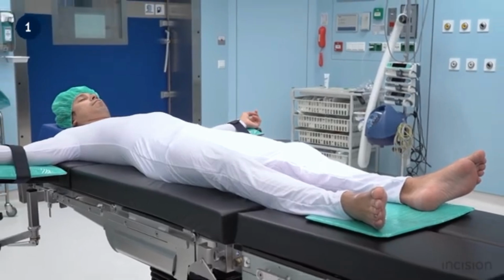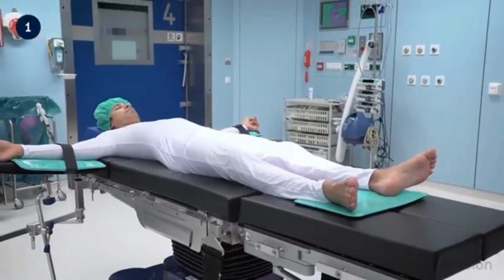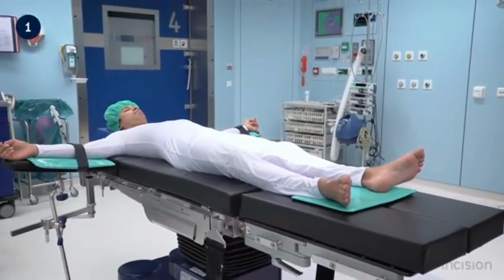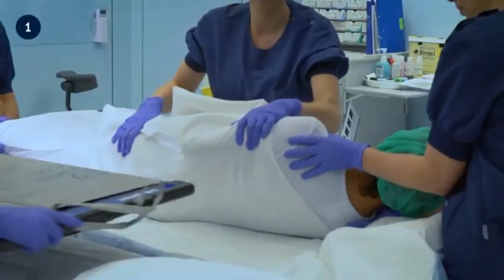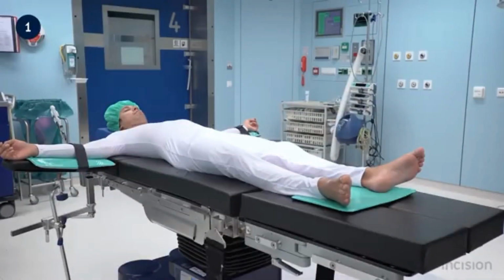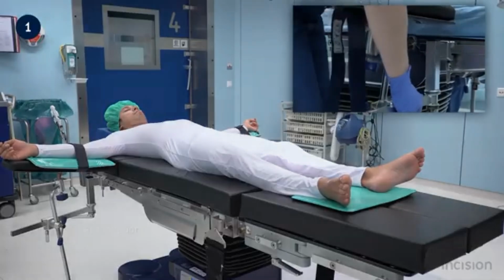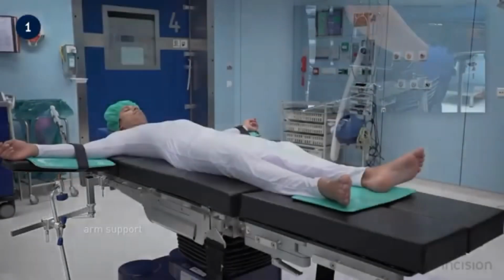Positioning of the patient on the surgical table is intended to optimize access to the surgical site, while avoiding complications that may arise as a result of the positioning. Safe positioning is the responsibility of all members of the OR team. The movement and function of the surgical table, as well as the coordinated actions of OR personnel, and the attachment and use of surgical table accessories, such as an arm support, will be discussed in this film.